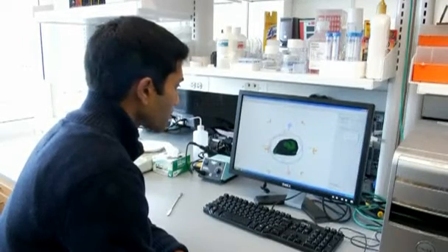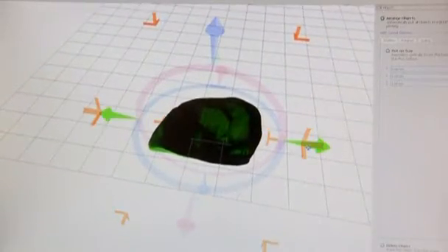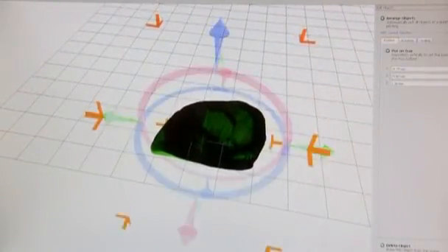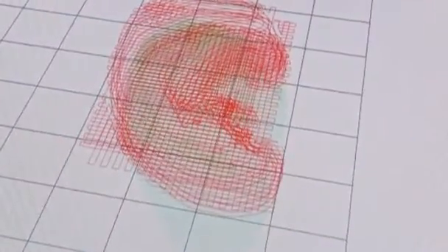To achieve the precise ear shape, technicians used 3D panoramic photographs and laser scans capturing the geometry of the patient's other ear, and then fed the data into a computer that translated it into a lifelike implant. The whole idea behind this is we simply don't want to put an artificial material in the body. That we want to replace ear cartilage that's absent or has been destroyed with new cartilage. And that's essentially what this tissue engineering technology does.